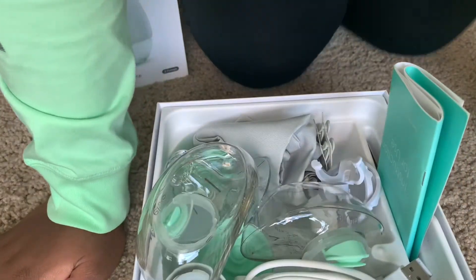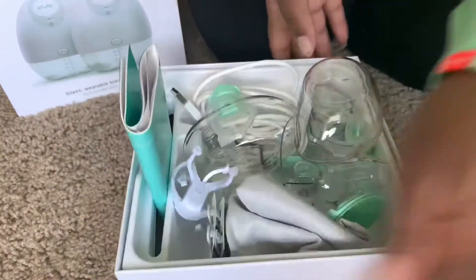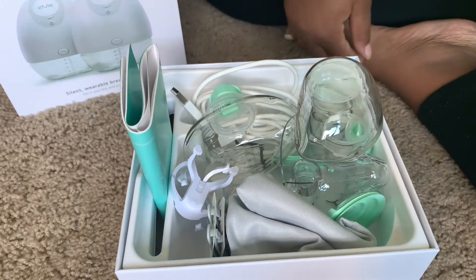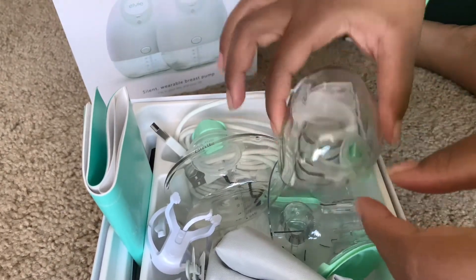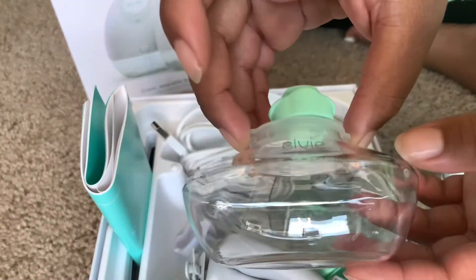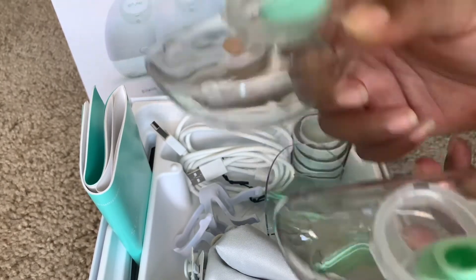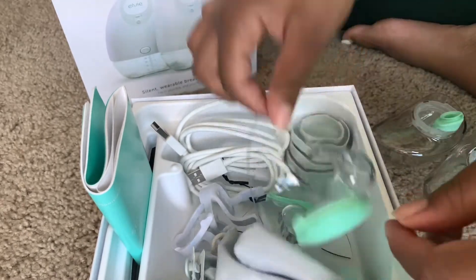So here is partially everything they give you in the box — they give you a lot of stuff. I still have some parts out because I've been using it. What I really like is they give you everything you need: the little bottles for the milk to go into, the lids to go on them. You can store your breast milk right in these bottles, which is great.